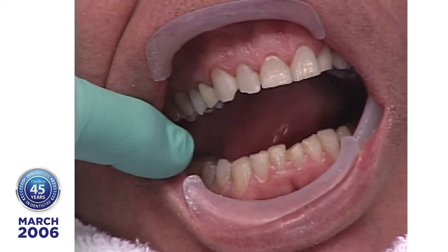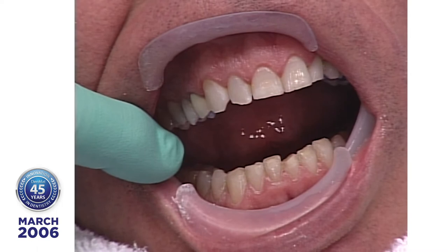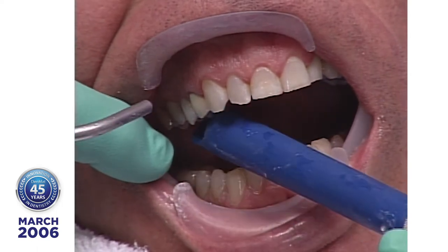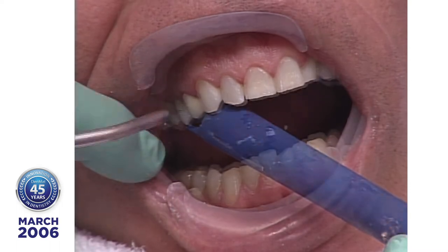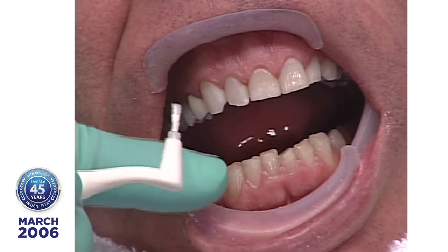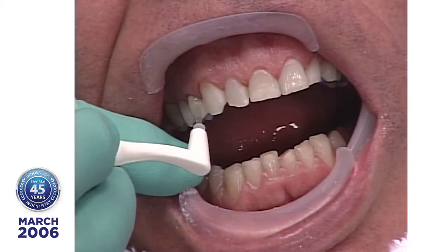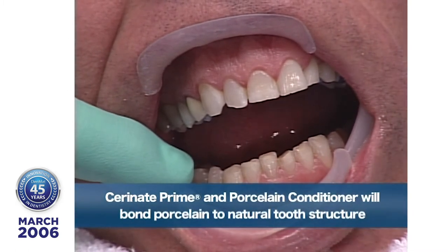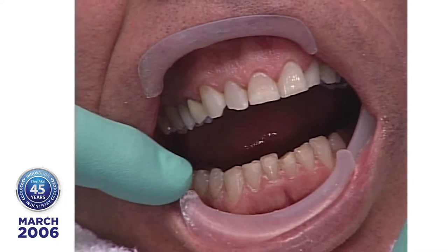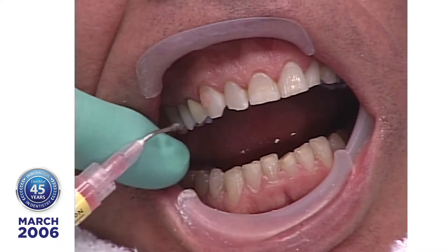This is after I have done what? Micro-etched. And if you don't have a micro-etcher, you can always use a diamond to take off the glaze. I want to be sure we get all this out. And this is Cerenate conditioner, porcelain conditioner. This is the organic acid that we're putting on there. Now, at this point, we're treating this porcelain jacket in exactly the same fashion as Lisa treated the porcelain veneers before the patient got in the chair.